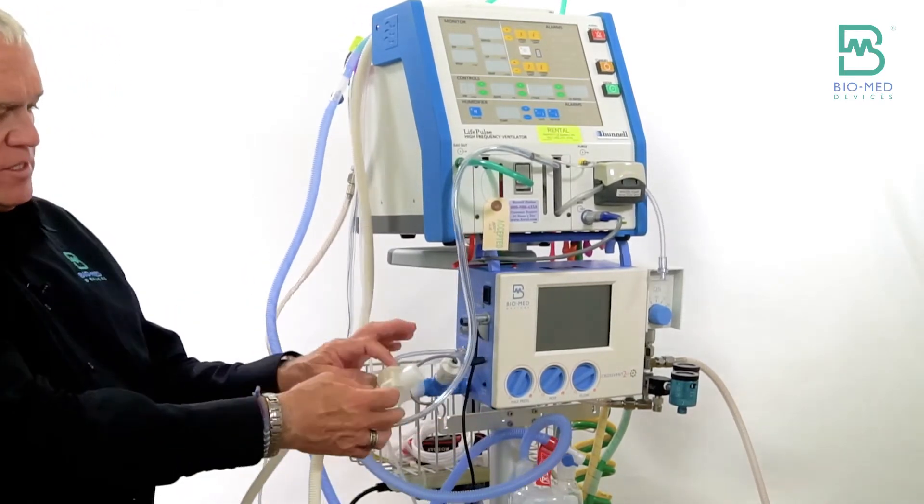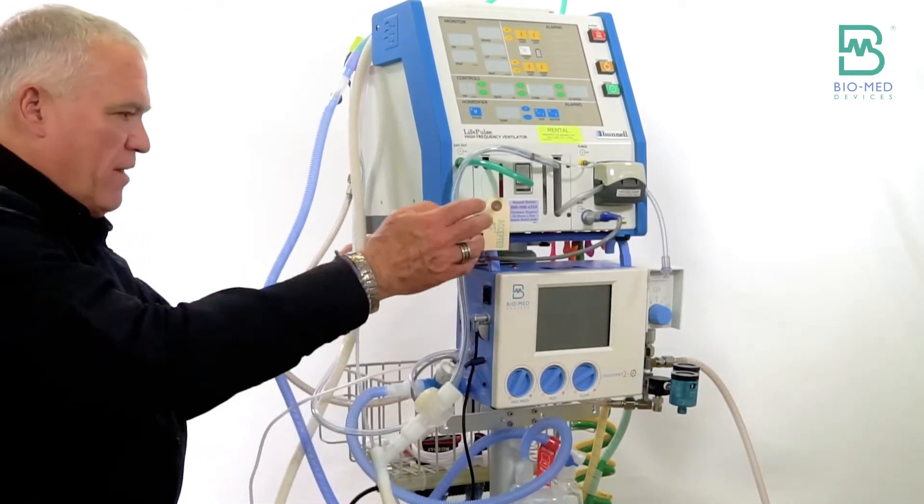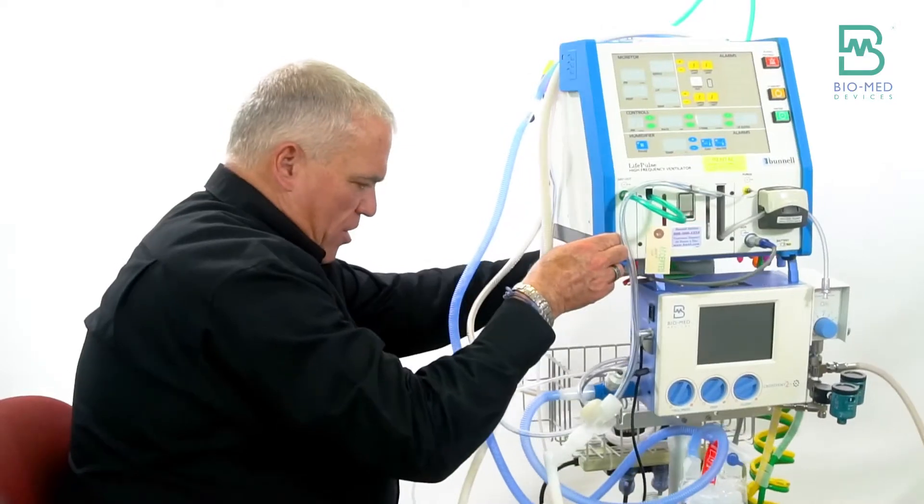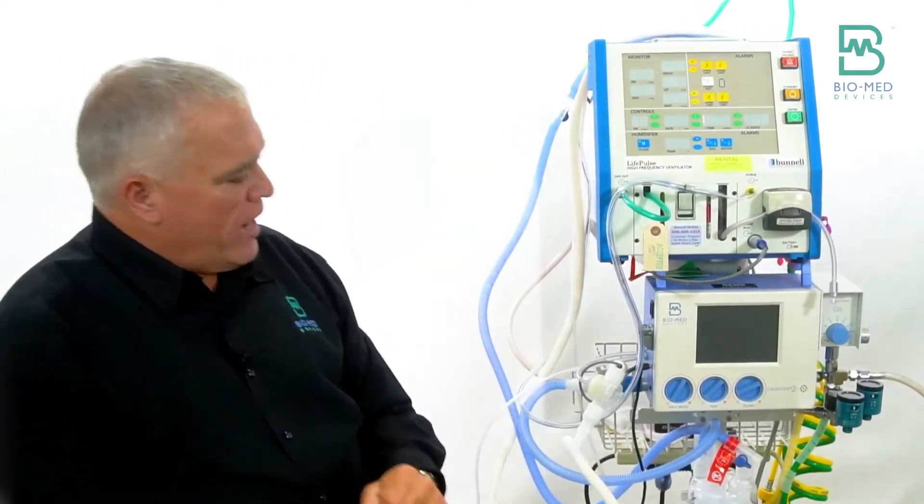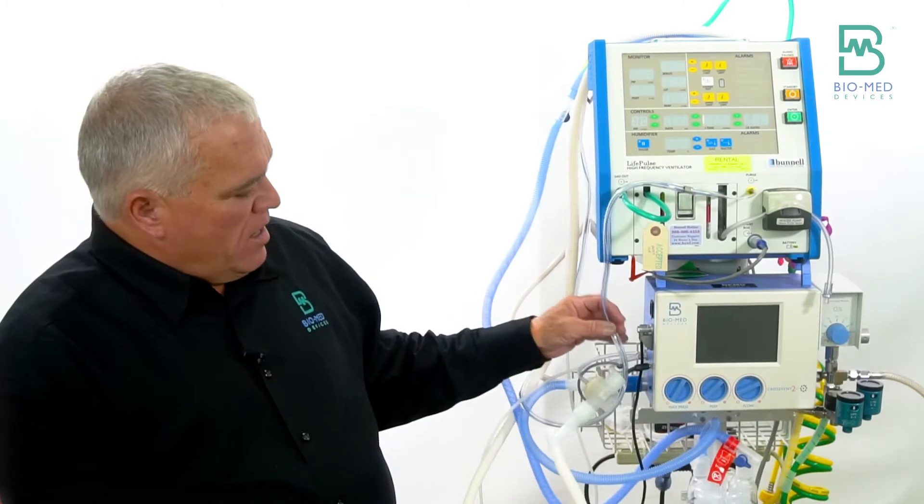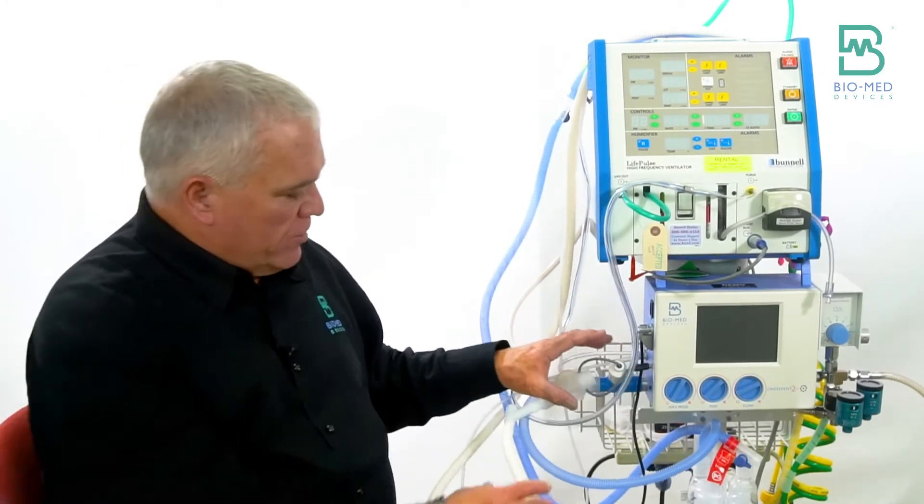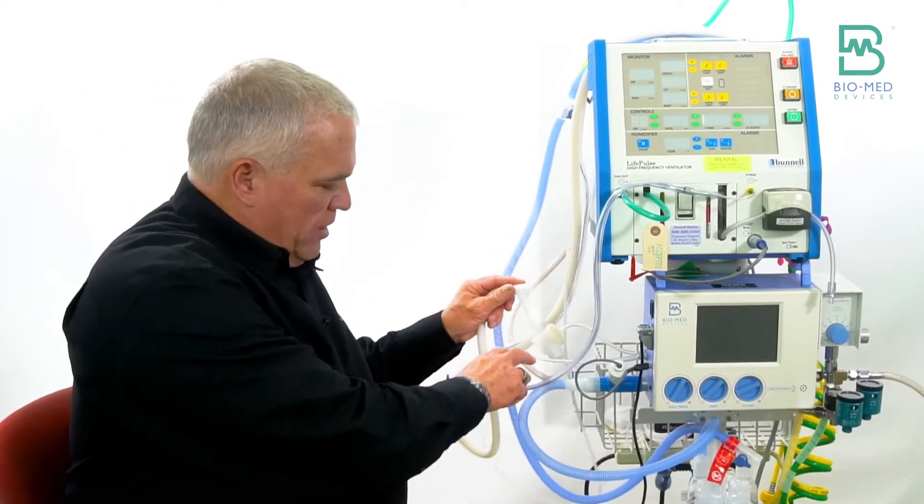We sell these in a kit. They come 20 per case. Part number is 2018D so that you can convert your heated wire circuit.